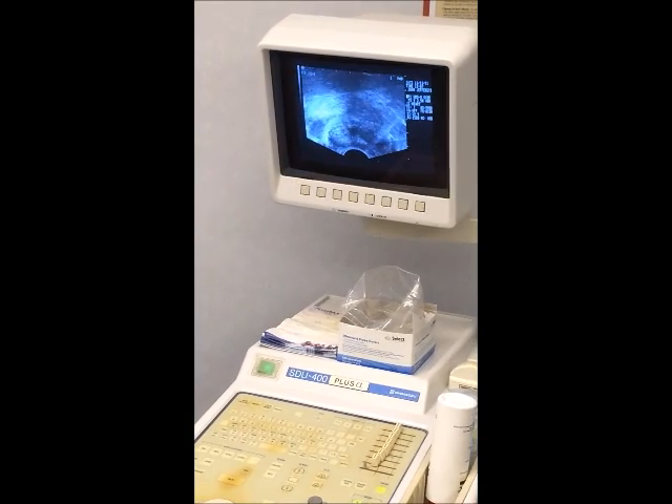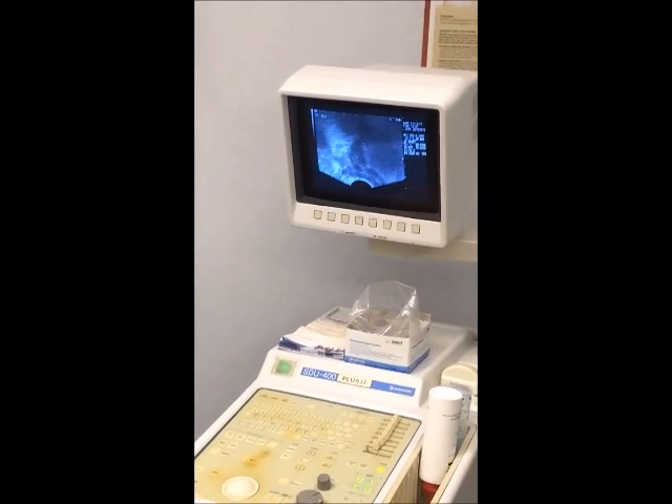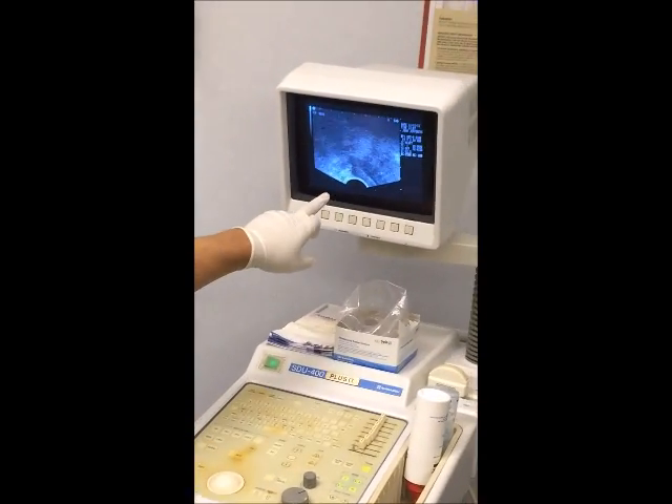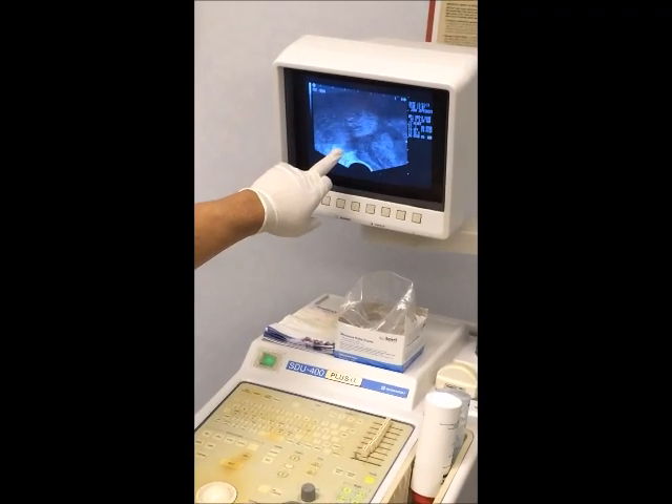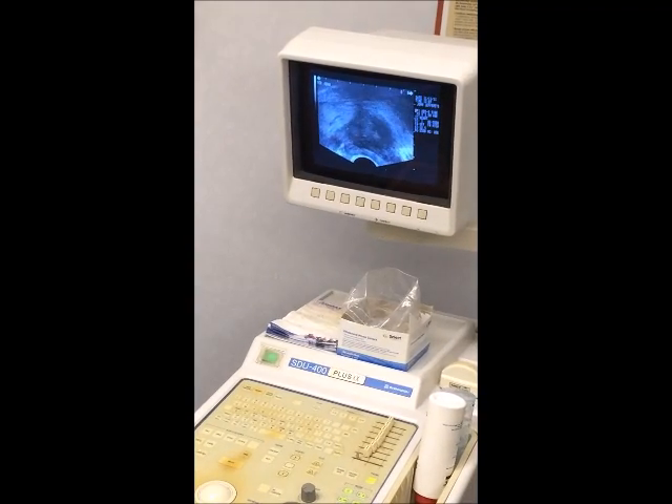Because this procedure achieves a very high temperature, the block should be effective. I put 10cc on one side and then go to the other side again — this is that area between the seminal vesicle and the prostate. We do the same thing on that side too.